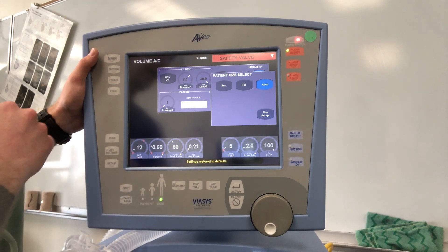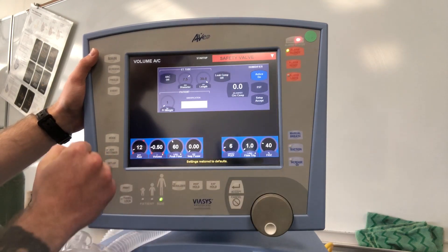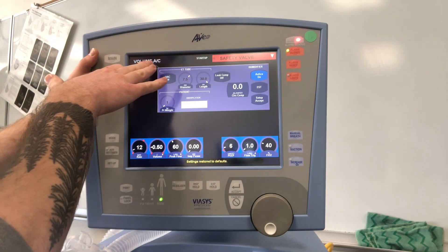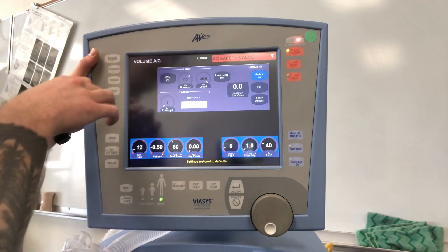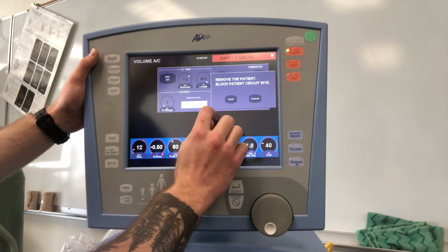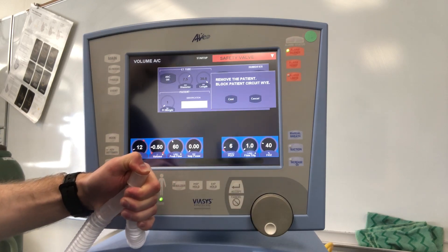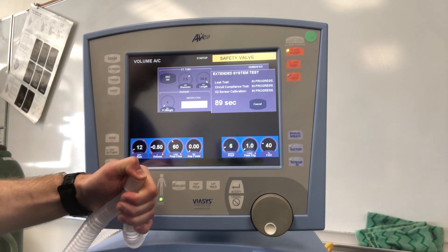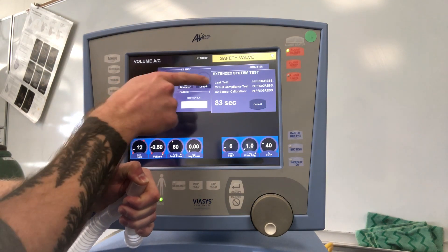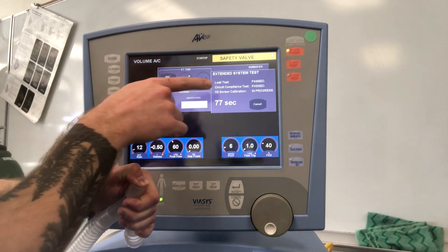It takes us to a new window where we select patient size: Neo, pediatric, or adult. We'll hit size accept for adult. It starts us in volume AC for initial startup and the safety valve will be open. We start by tapping EST — it will ask us to block the patient Y after disconnecting from the patient, using a glove or cap. Hit continue and it takes 90 seconds.